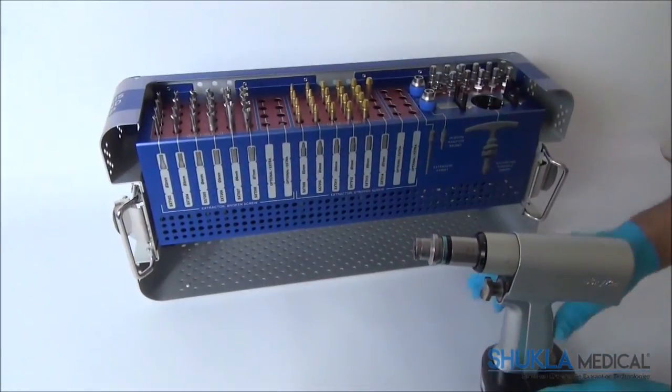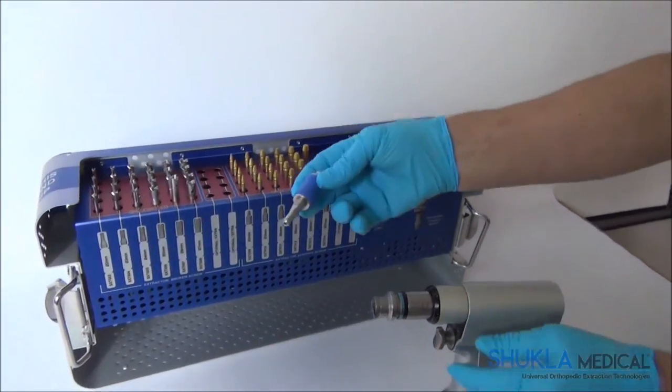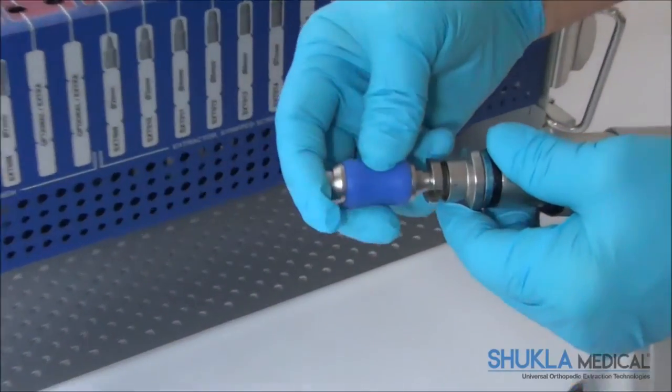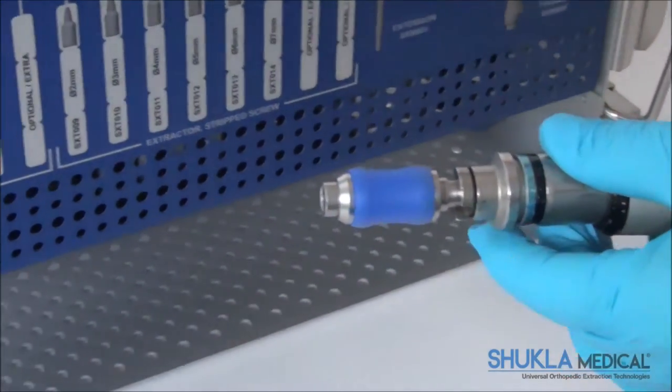The broken screw extractors may be used under power, utilizing the Hudson Extractor Interface, or by hand, utilizing the T-Handle.